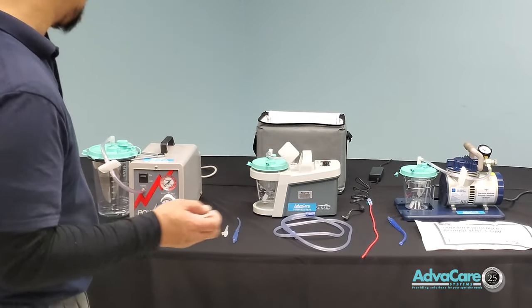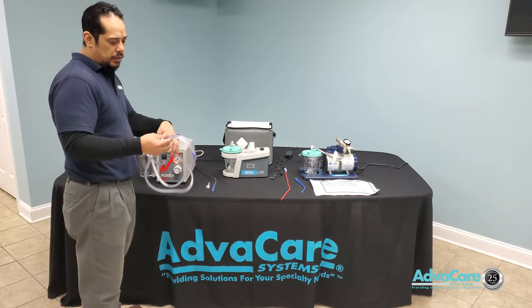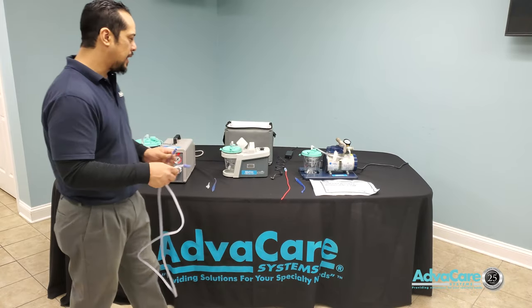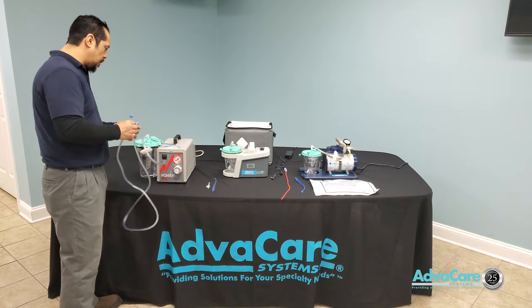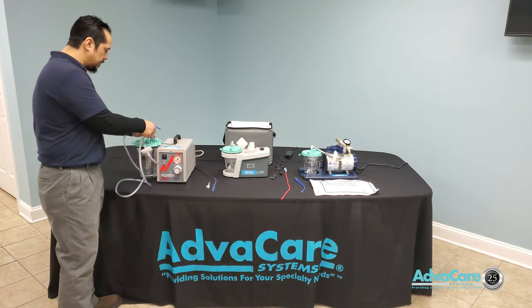We would use the same universal suction tubing that is connected to the Yankauer, and connect one end to the open port on the canister lid.